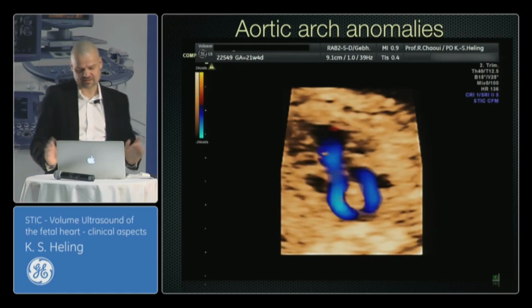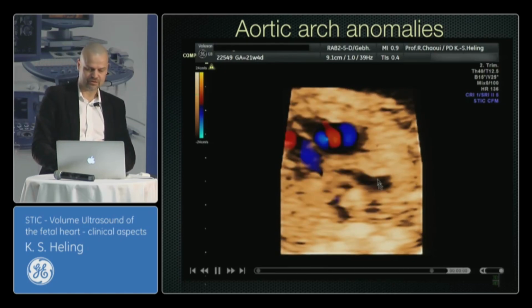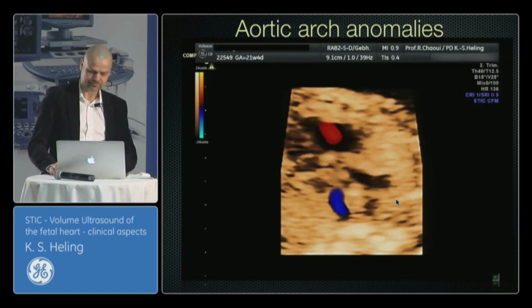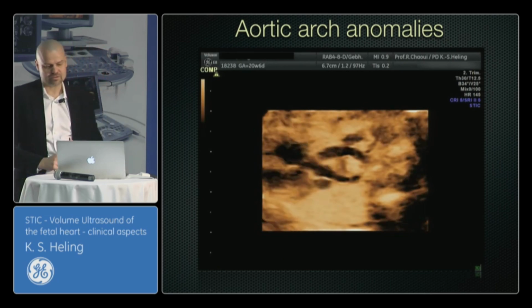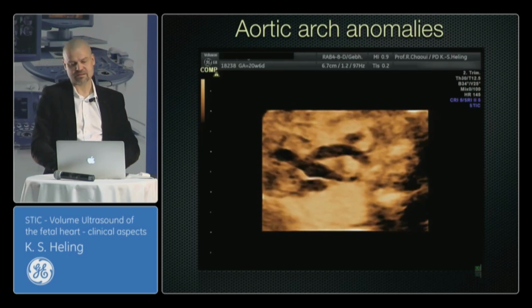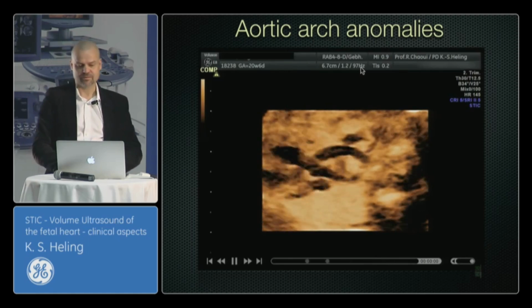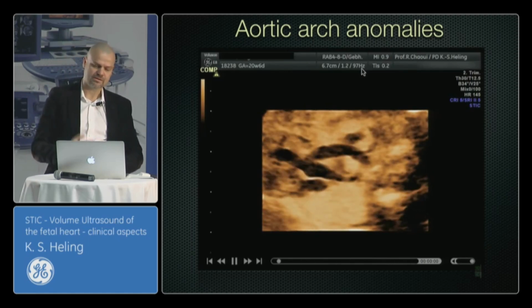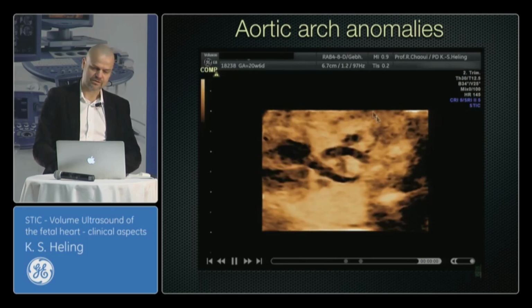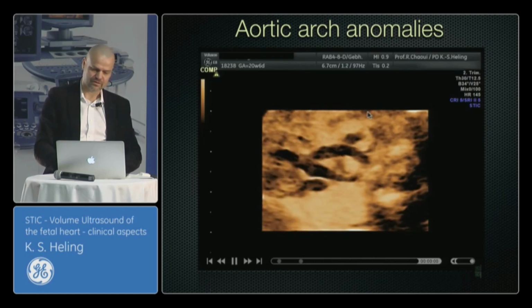And a classical case, right-sided aortic arch, combination of grayscale information and color Doppler, glass body mode, and you see this arch. But you can use it also with minimum mode. And the advantage in minimum mode is that you don't decrease the frame rate of your image, with 97 Hertz. The quality of the image is much better than using color Doppler, and also the power you bring to the fetus is less than using color Doppler.